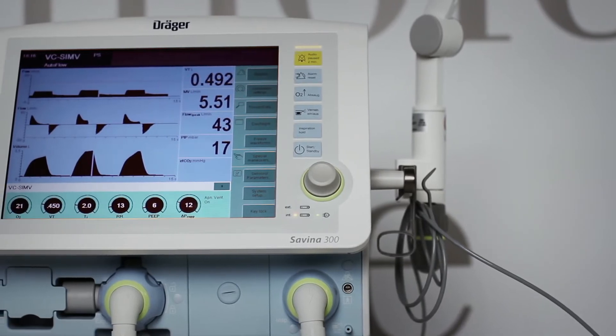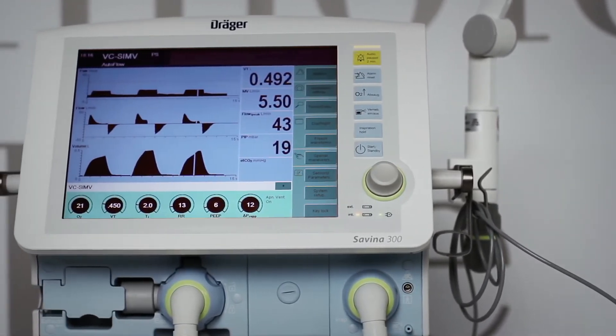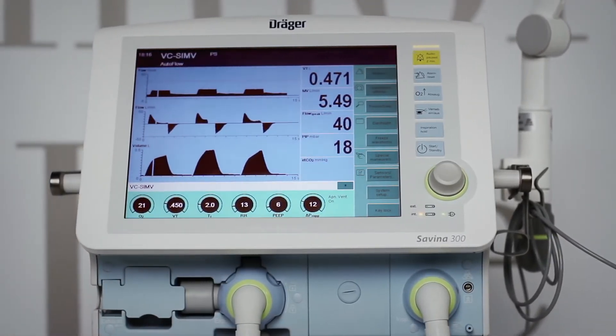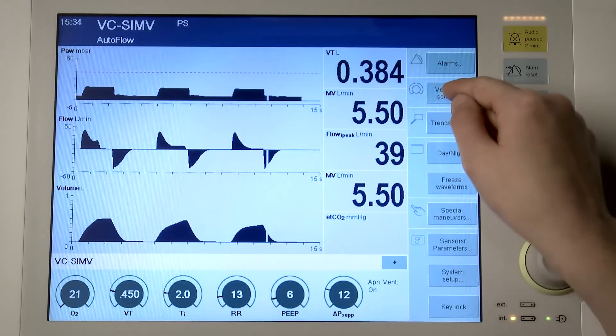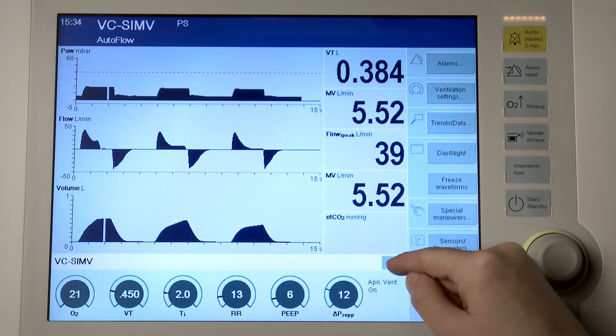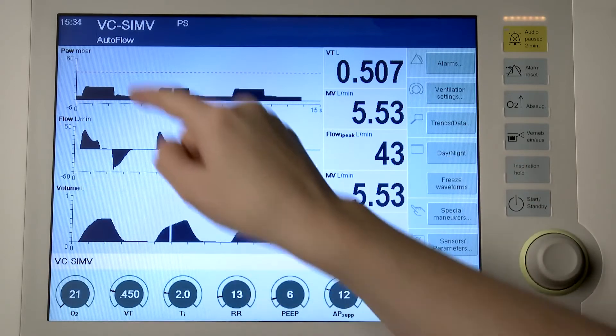This chapter describes how to select ventilation modes and additional settings and how to set ventilation parameters and alarm limits. You have three options to open the ventilation settings dialog window to adapt the ventilation settings: touch the ventilation settings button in the main menu bar, touch the button in the therapy bar, or touch the displayed ventilation mode in the header bar.